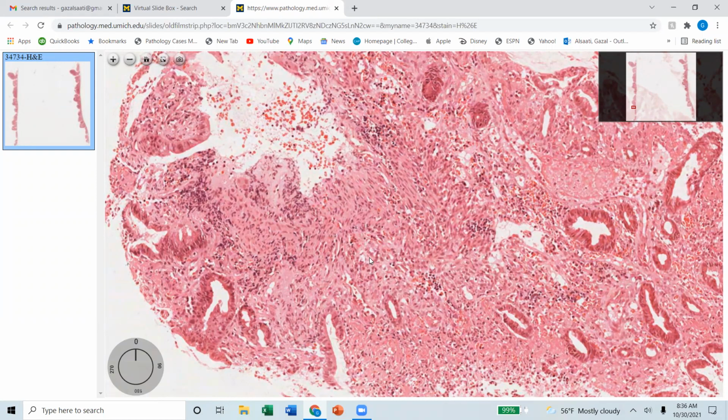Yeah. So, if the patient has history of IBD and I see chronicity, I say quiescent colitis, okay? Or you can say chronic colitis, no activity, consistent with patient's history of IBD, all right? If I have chronic colitis features, no activity, no history, okay? I will be descriptive: crypt architectural distortion or basal lymphoplasmacytosis or glandular disarray or whatever the chronicity feature is, I would say see comment, okay?